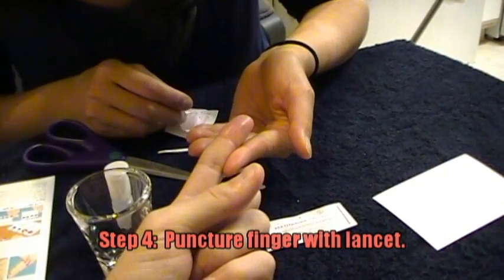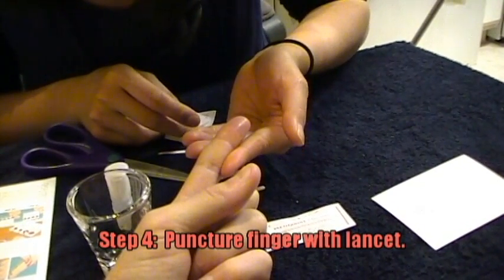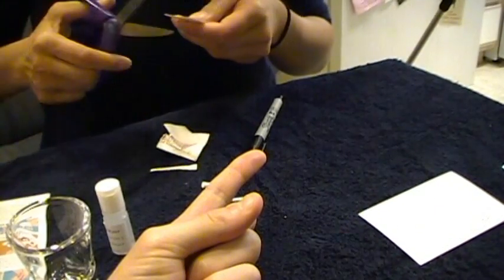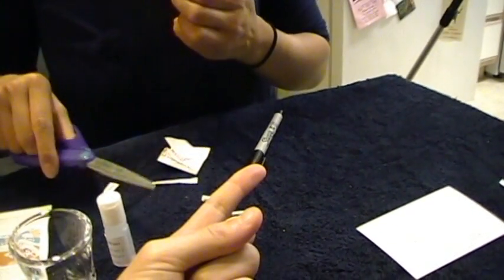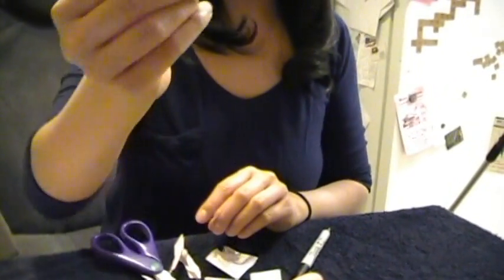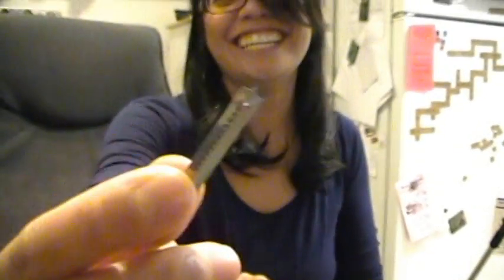Step four, puncture the skin by pressing the lancet firmly against the side of the fingertip. A friend may assist you. Can I puncture myself? Are you serious? Kinda, yeah. Do you not trust me to poke you with this? Can you see it? Yeah.